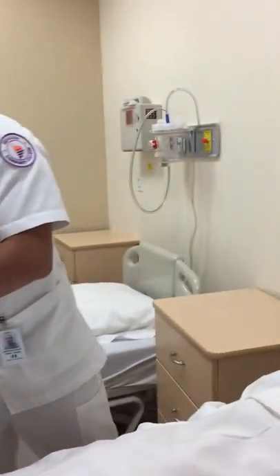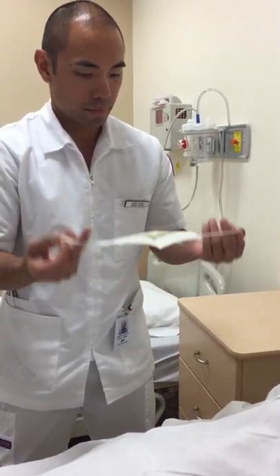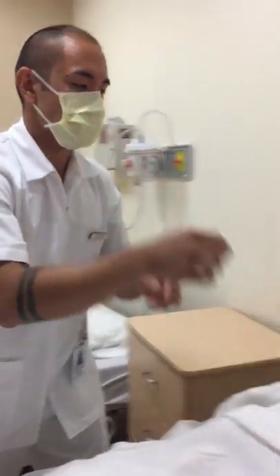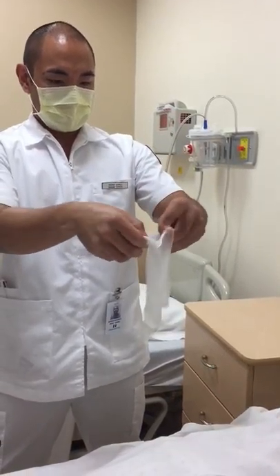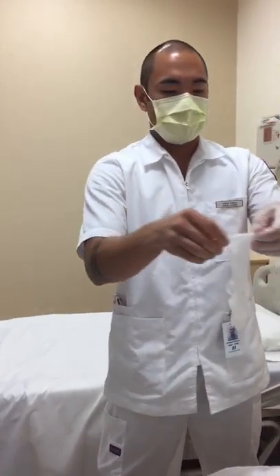Now I'm going to go ahead and put on my mask. Make sure to pinch my nose, and making sure it's pinched on the patient as well. I'm going to go ahead and don my regular gloves. Now I'm going to take a look at the central line and assess it as well.